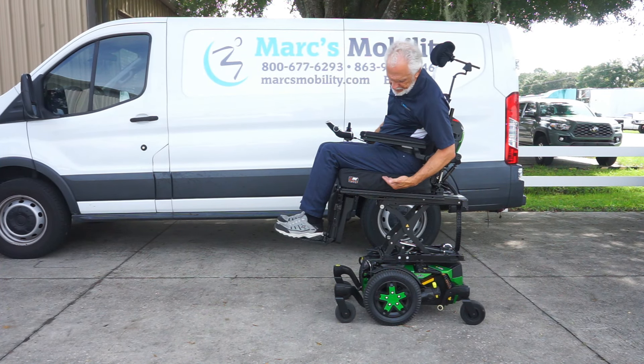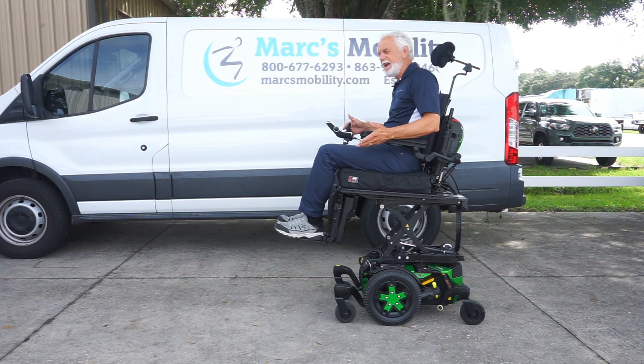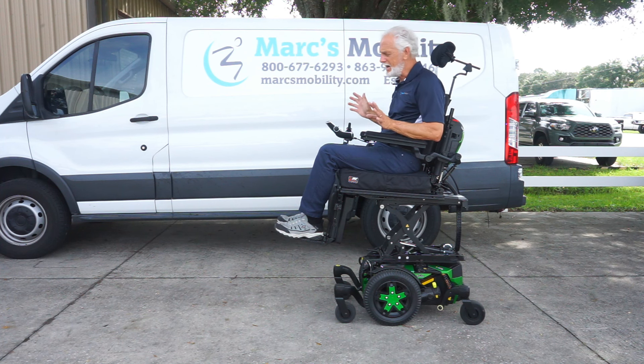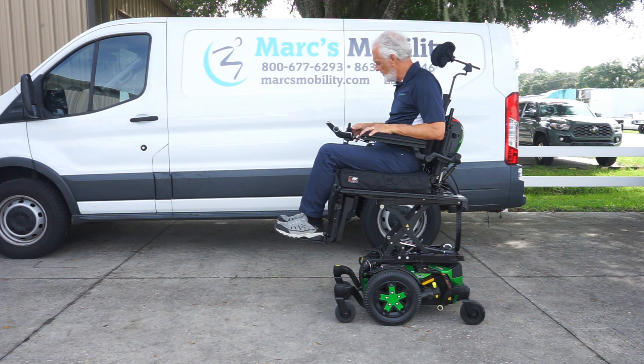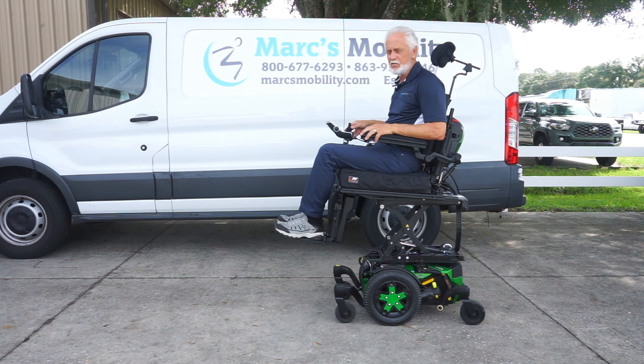You can see the seat elevation — it has the tilt, the recline, the legs. This chair has eight miles now — it went from seven to eight — so let's just say it's got eight miles total. Swing-away joystick, memory foam cushion, gel arms, lights — just a nice power chair.